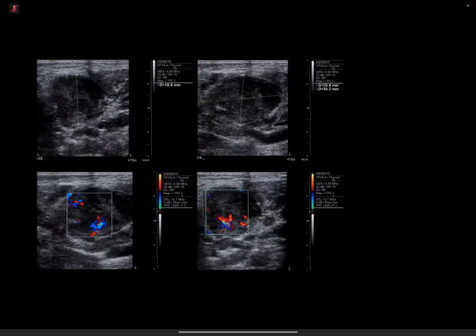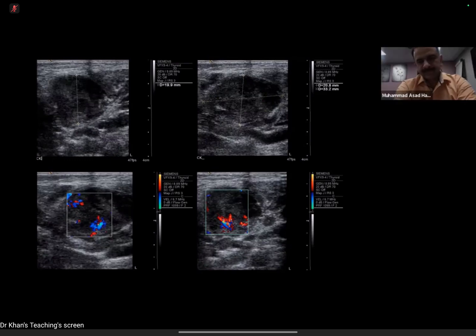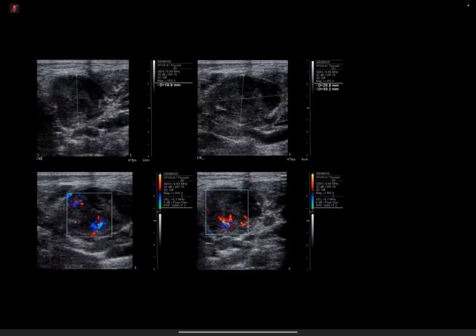Well, actually, I'm not sure that's true. In a different axis, it's wider than tall. So I think it is actually wider than tall overall. It shows some vascularity at a point at the mid-inferior part of it, and that area is slightly more hyperechoic. The overall appearances are that this looks like a lymph node. Good. Size is larger than would be expected, I think, in any anatomical location.